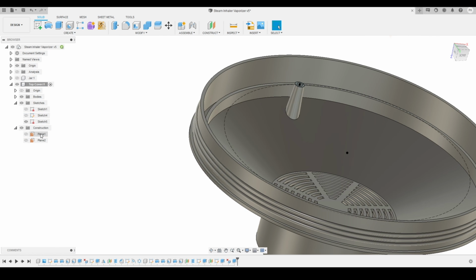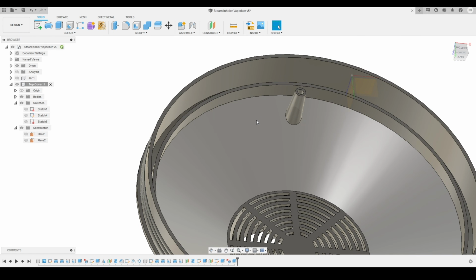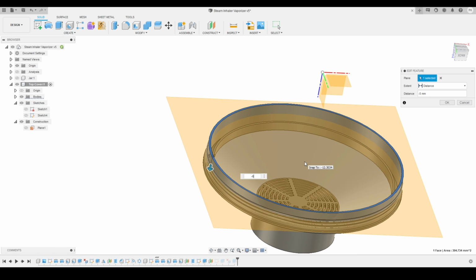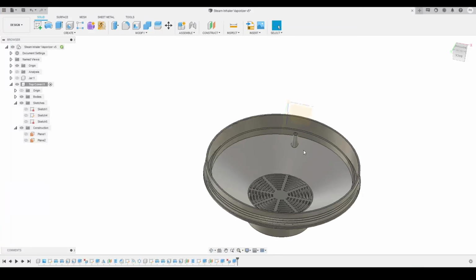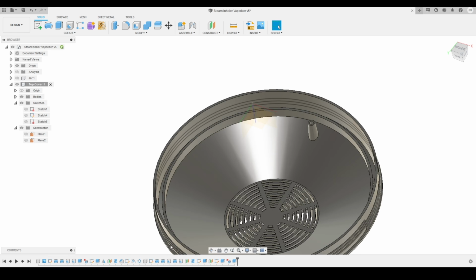So here you can see this is the kind of profile we just created on this particular part, this top cover. Now what I'm going to do is edit this offset plane a little bit. Instead of -5 I just want to move it a little bit downward, so the length of this particular piece will be decreased by a small amount. So this is how we can do adjustments in our model using all the tools that are getting recorded here.